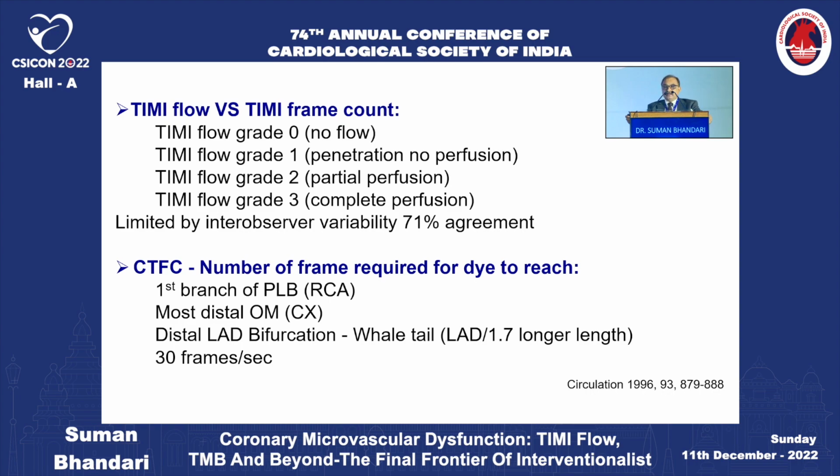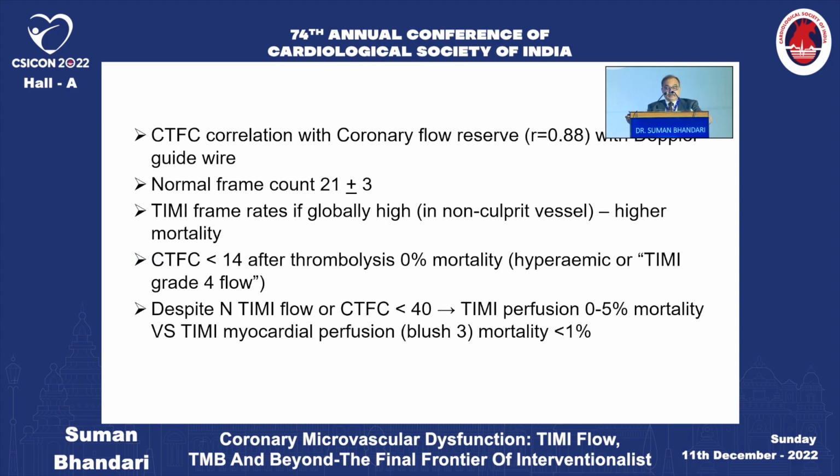And because the LAD is larger, you divide it by 1.7 and you count it in 30 frames per second cine.